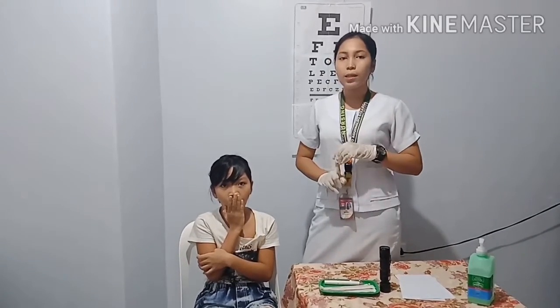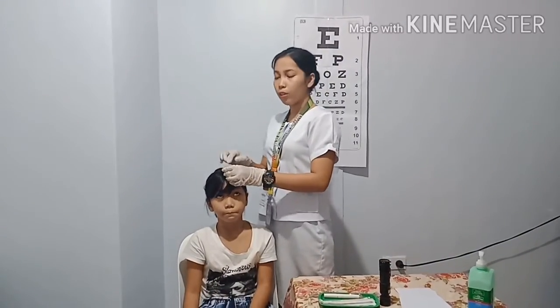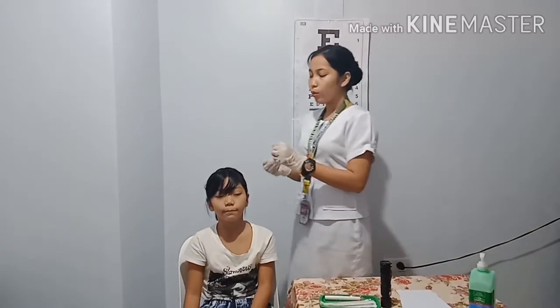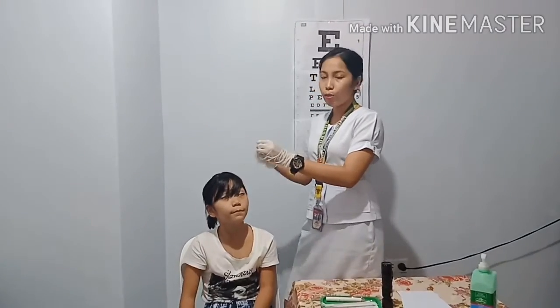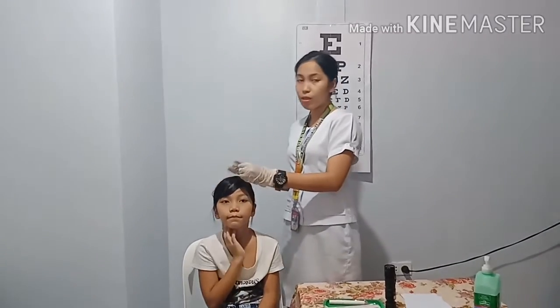The Weber test tries to assess bone conduction by examining lateralization. So, yung tuning fork, hawakan siya sa base nun. Then, hampasin sa any surface, and it is placed on the forehead or the upper head part of the client. So that we can ask if the client feels any vibration or sounds.